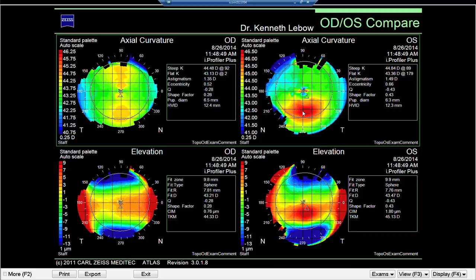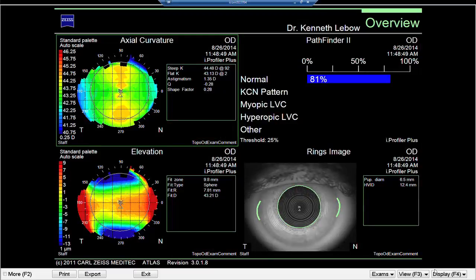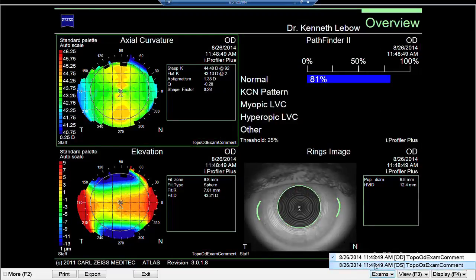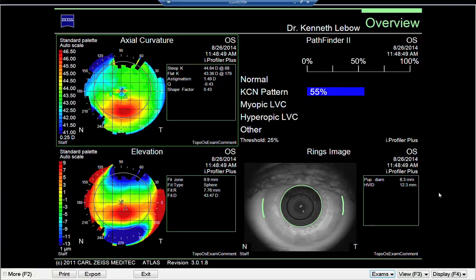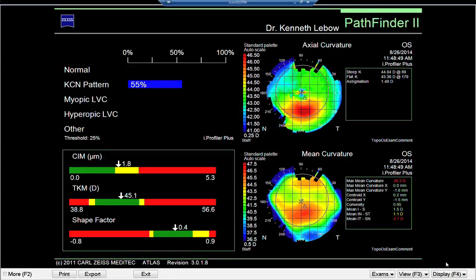Although there are a number of other situations that will mimic keratoconus in a topography situation. Now, if we look at the overall map, we see that the topography is associated with what the computer thinks is a keratoconic pattern. The next thing we're going to do is go to Pathfinder.